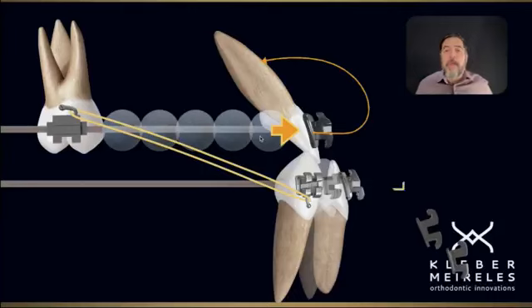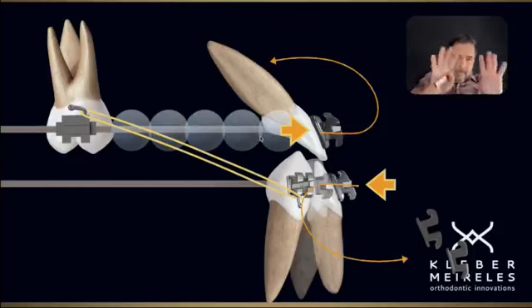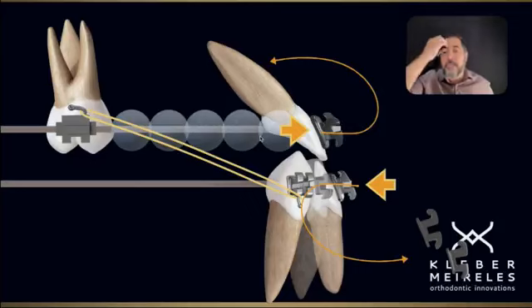And in the lower arch, same thing is going to happen. We are going to have a moment that is rotating lower teeth, and the view here, the sagittal view, is inclining lower anterior teeth further lingually in the crown. Okay, and this is also not very good in many cases. So the bracket that was intended for finishing may be not a good bracket for movement. So there is another thinking about it.